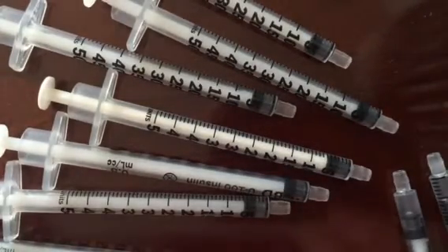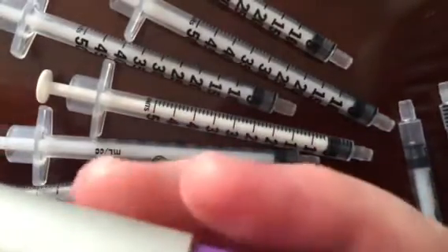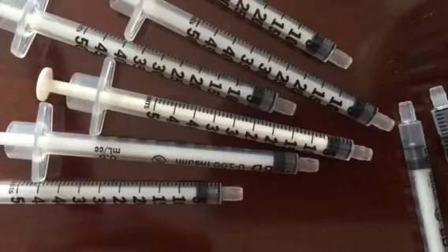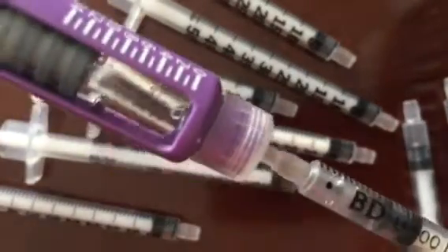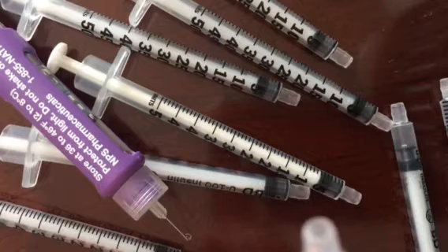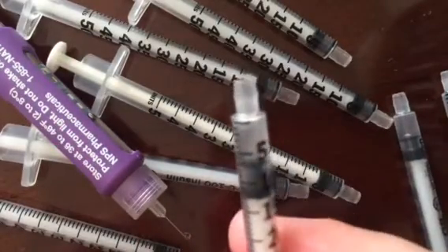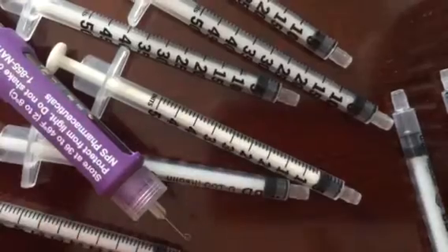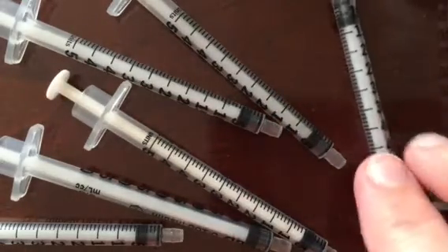So, oops, I bent my needle. All right, so this one, that should be the 3rd dose in this pen. Push all the air out to the top point. And this time I got, well, there's 5, 6, 7. So 7 again. All right, so these are the 3 days so far.